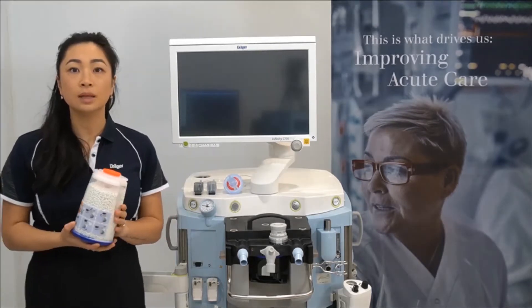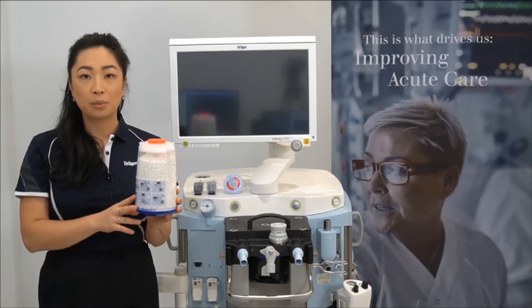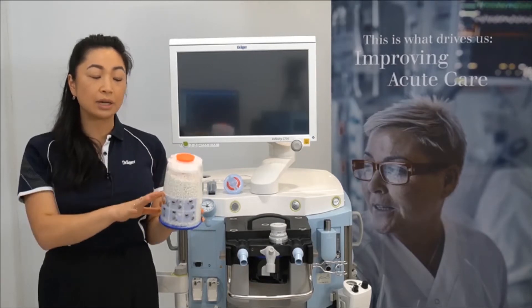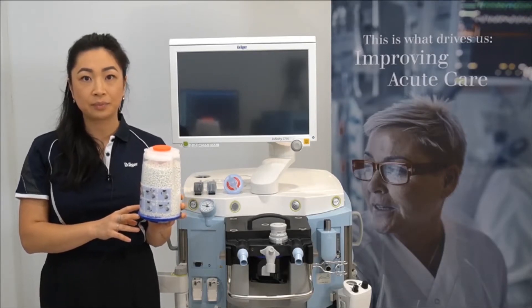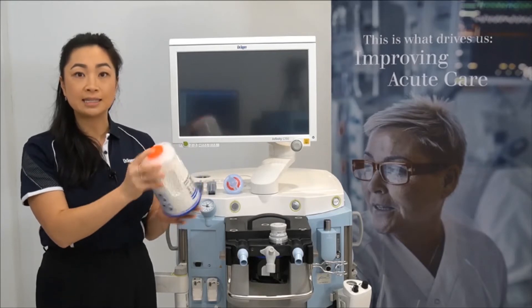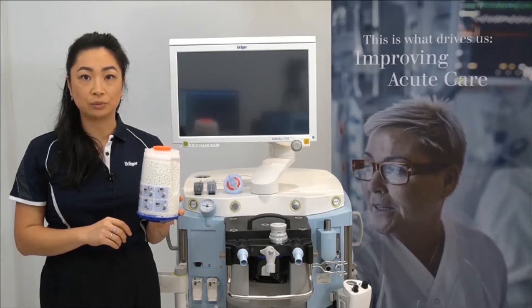To start, I'll be inserting the soda lime. Prior to inserting the soda lime, just visually inspect the integrity of the canister to ensure there are no visible cracks, as this can be a source of a leak. Then, to loosen the granules, you can turn the canister upside down a few times — this may increase the longevity of your consumable.